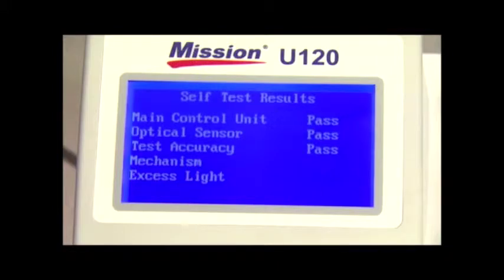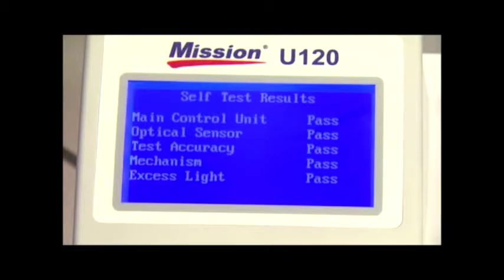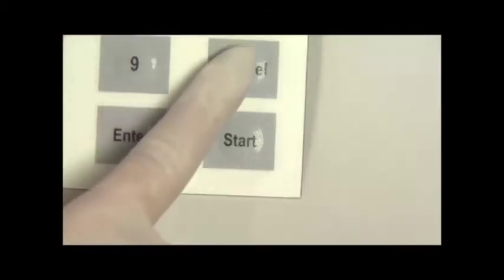If any of the results fail, the unit will not operate. You can refer to Section 10 troubleshooting of the manual if you have failed results. Press cancel to return to the menu.